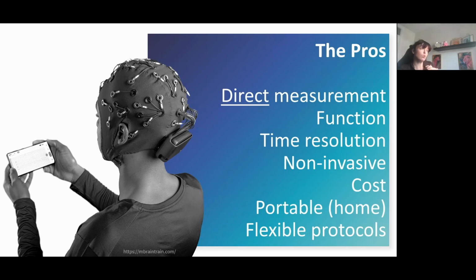Even if you wanted to do some home-based monitoring, some follow-up, or some screening, that could also be done with these portable systems. And then overall, a great thing about EEG is that it's very flexible in terms of protocol. So depending on what you're trying to measure, the protocols can be customized to maximize participant comfort and to fit in with the timeline of your day. One great example of this flexibility is that for EEG, your participants don't have to be lying down. They could be sitting up, they could be comfortable, they could be in different environments. It could be recorded at the bedside, for example. So it has a great ability to integrate into a clinical trial.